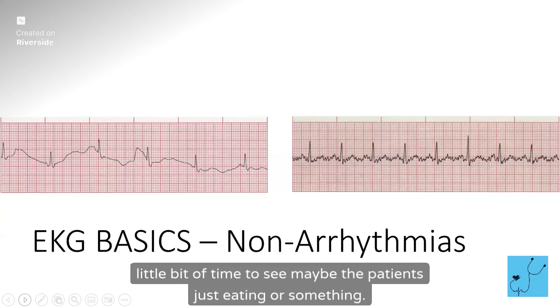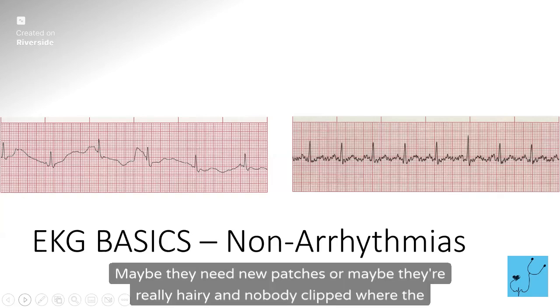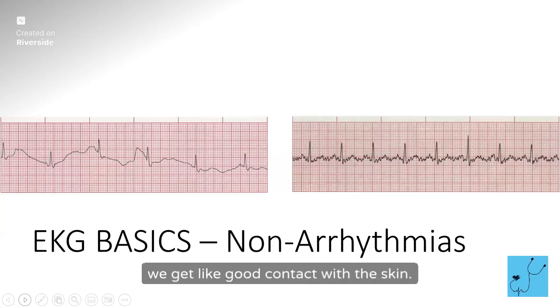I would give that a little bit of time to see maybe the patient's just eating or something. And then after 5 or 10 minutes, hey, there's a lot of artifact in your waveform. Maybe they need new patches, or maybe they're really hairy and nobody clipped where the patch goes, because we're supposed to clip and use alcohol wipes to make sure it's clean and dry, and then put the patches on so we get good contact with the skin.